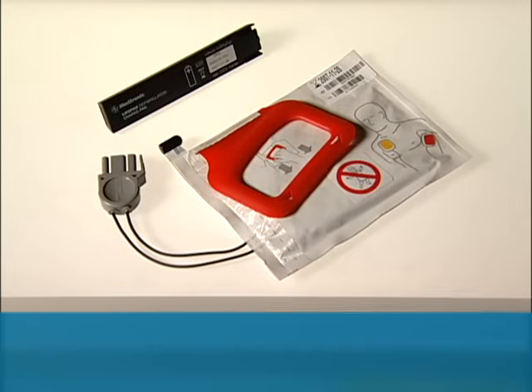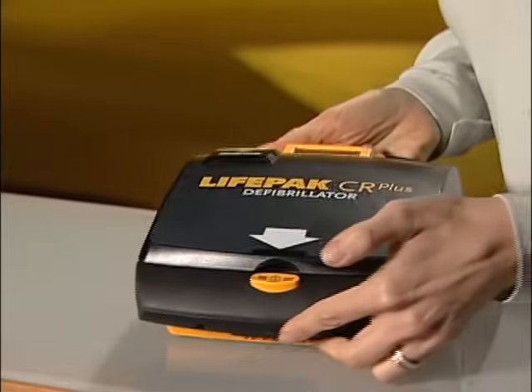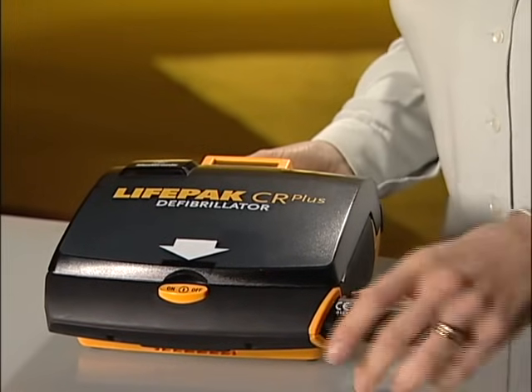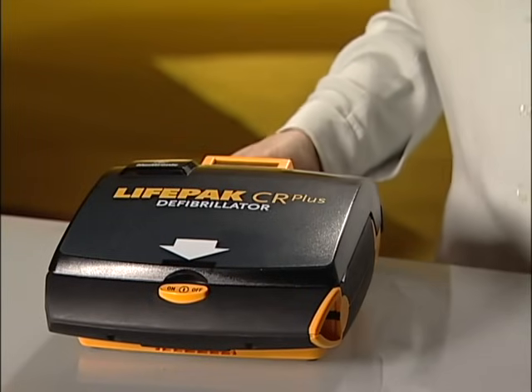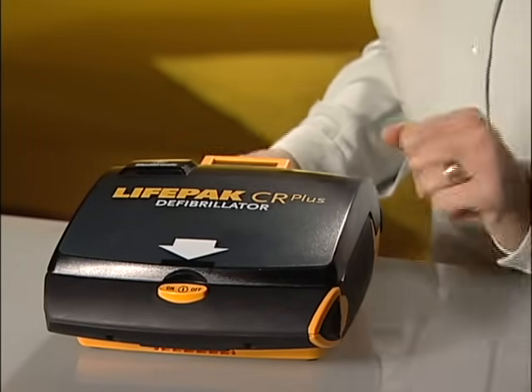If you ever do have to use the AED, there are a few steps you need to take so it's ready in case you ever have to use it again. Be sure to refer to the user manual for a complete description. You'll also find information there about how to replace the electrode pads and the battery charge pack when they pass their use-by date. The charge pack goes right here. Squeeze this little latch and slide the old one out. Then slide the new one in until it clicks.